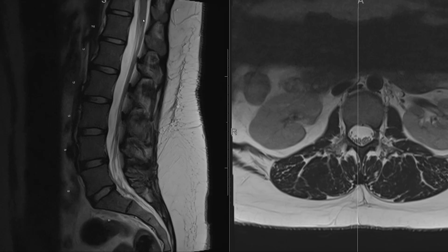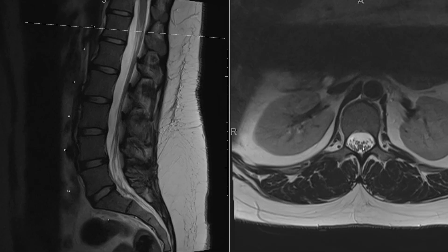We can see the distal thoracic cord, which terminates in a narrowing, tapering down to a point — that is the conus medullaris. This is where it gives off all the nerve roots, both the ventral and dorsal, that are going to exit at all the levels below the conus. That collection of nerve roots is the cauda equina.